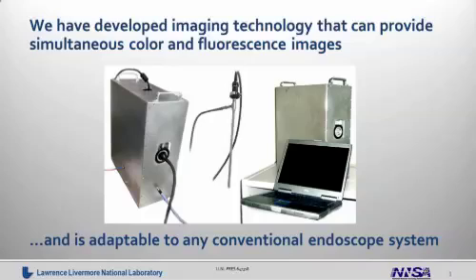In this particular case, it's attached to a laparoscope, and the attachment from the tip of the laparoscope is transferring the image into the box where it's analyzed. At the same time, the box provides a specialized lighting that not only provides for visible, conventional imaging, but also provides for excitation of the chromophore, which subsequently emits and provides visualization of the target area.